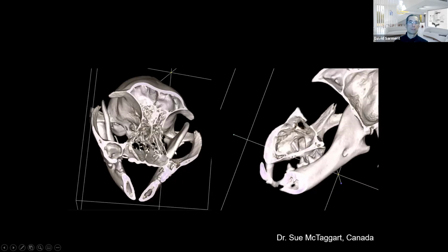And here is this same case I just showed you a moment ago, but in a different view now, where we can take the 3D and cut it off, crop it. And when we crop it, we can sit on the tongue, sit on the roof of the mouth and look at the defect. Now everything looks really, really large, although it's very small on the patient. We can zoom in and see that root sitting in this defect. Everything becomes very obvious to us because we can turn on this anatomy to our advantage and crop it off and really look at some details in a view that's not available in any sort of projected image.